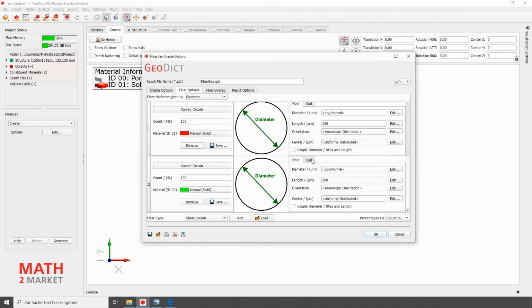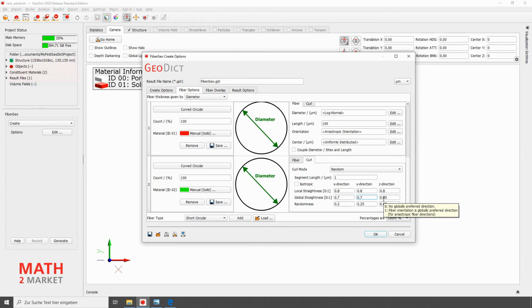Now we change the curvature parameters so that we get straighter fibers. For this, we increase the local straightness in all directions and also the global straightness. This means on the one hand that we want the fiber to follow the given orientation more closely and to maintain its current direction rather than its curvature, and on the other hand that we reduce the randomness. We have now entered all relevant parameters and can click OK.